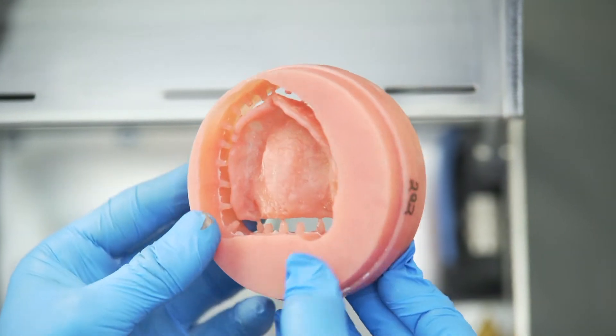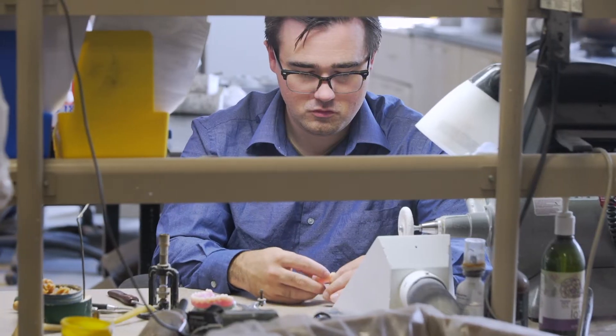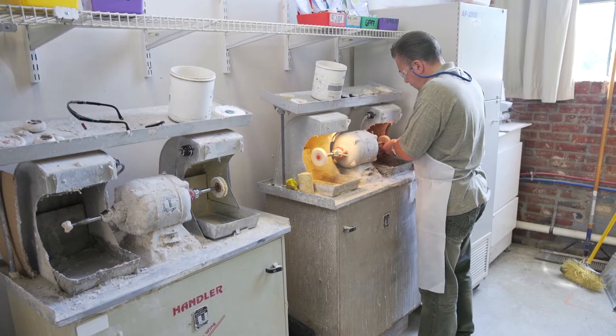We've been using the Keystone Industries Key Mill Denture Base Disc, which has really been improving our efficiencies, cutting out our traditional process times. We've lowered costs and still have the same beautiful and effective product as traditional materials.